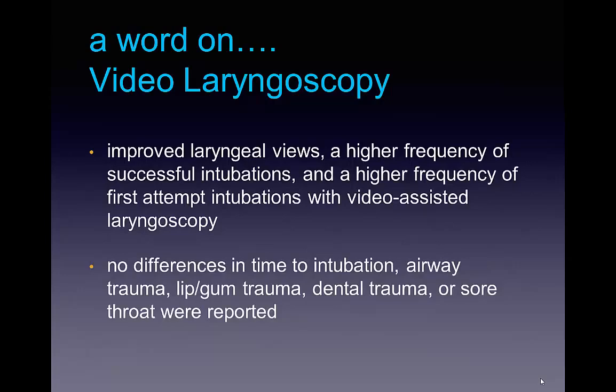Typically, as you're developing your skills, it's important to gain those skills with a direct laryngoscope. That's because the direct laryngoscope is what you have on the floor readily available in the airway boxes. And in fact, in the crash airway situation, when a patient is not ventilating and obtunded, for example, during a cardiopulmonary arrest, you certainly are just going to have a laryngoscope. So it's always good to develop your laryngoscopy with a direct laryngoscope and then to learn how to use video-assisted devices such as a glide scope.